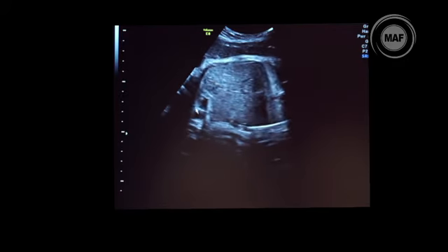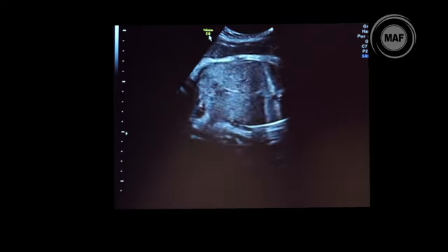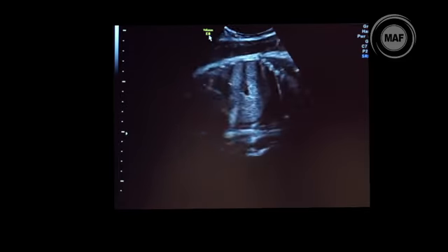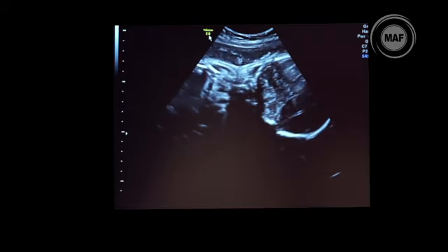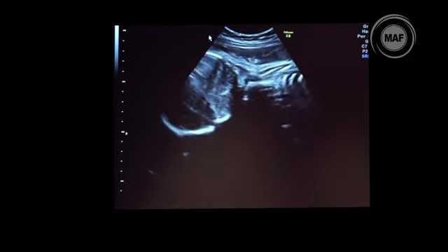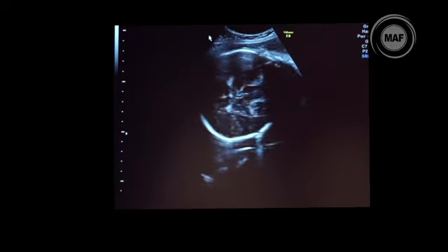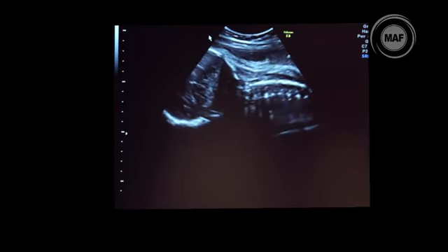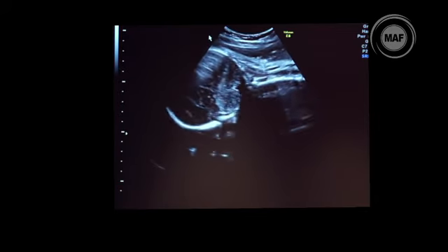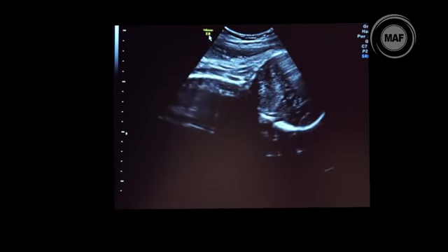Now this again does not change. If you have moved it, I move back into the longitudinal section. If you reverse the orientation, when you go down, the wrong part of the screen is coming into view. This will mistakenly say the baby is in a breech position when it is not. So make sure the marker is facing the correct way to the groove.